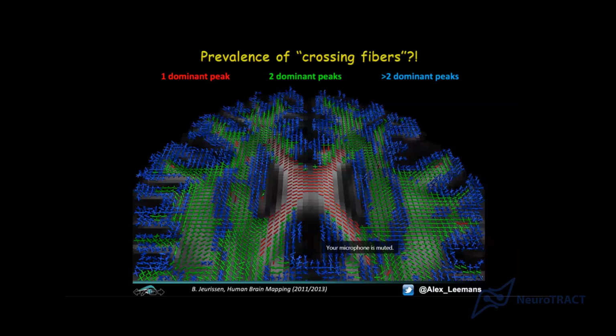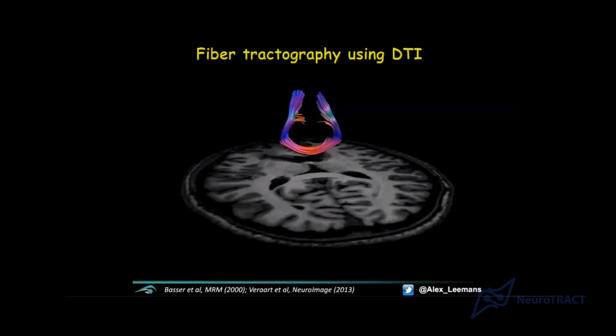Again, this is data driven. So purely based on the data and the resolution that we have in our data, this is what we got. The vast majority had at least 2 crossings or more. Right? In green, you see regions, voxels with 2 crossing pathways, and in blue, with 3 or more. Okay? So yeah, that was quite exciting to see that the vast majority of voxels at the resolution that we're imaging contain pathways that literally have different angular information, right? And so we thought that was cool.